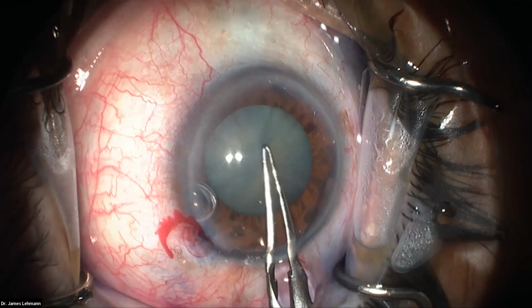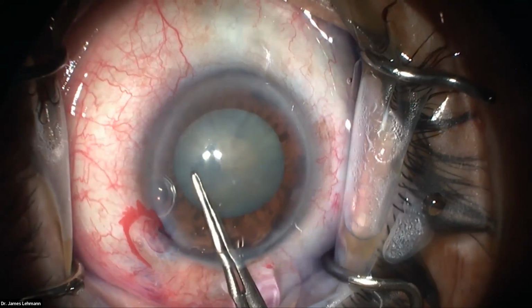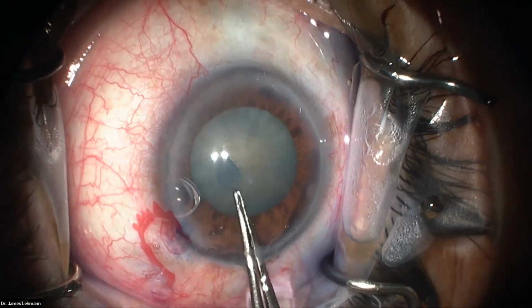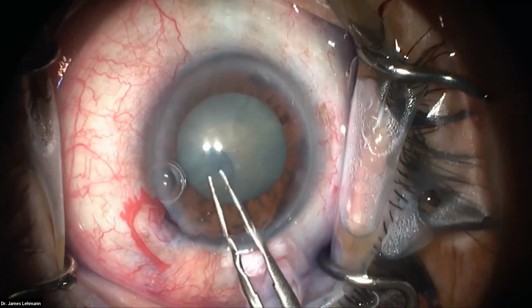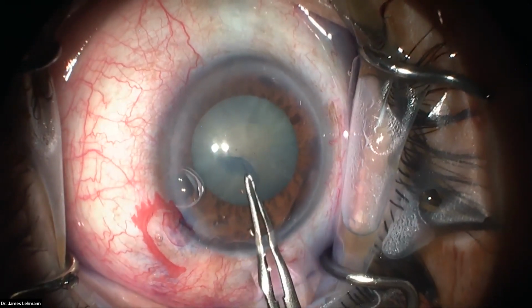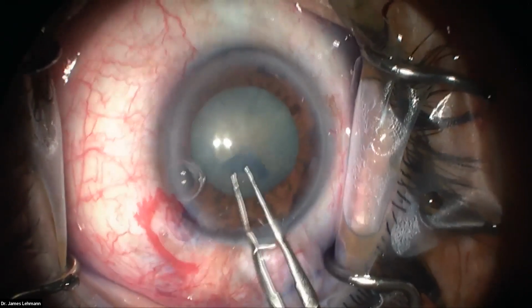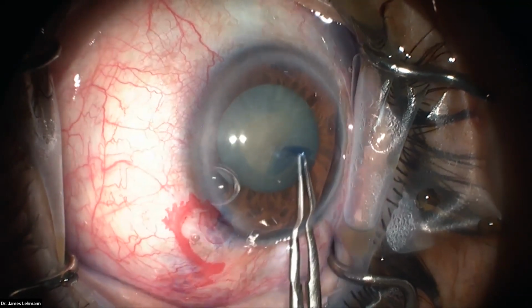So I'm grabbing the little leaflet I made and I'm kind of dragging it here. You can see I'm always like one step ahead. I'm wanting it to go left, but I'm already pulling down. You see, now I'm wanting it to go down and I'm already pulling right. You have to be one step ahead of the Rexis. And you want to start small because these have a tendency to want to run out. You want to be about 2 millimeters from where the tear is engaged.